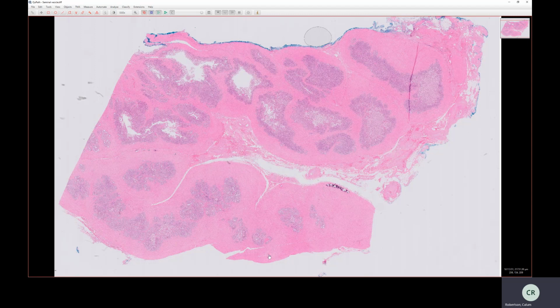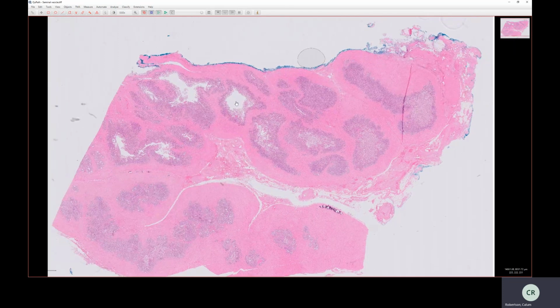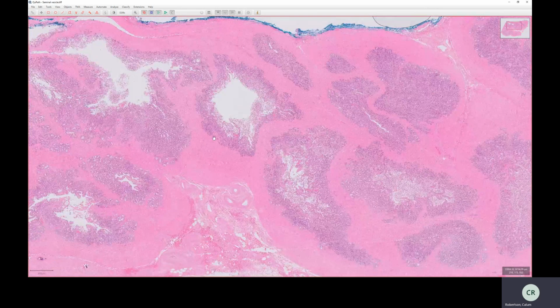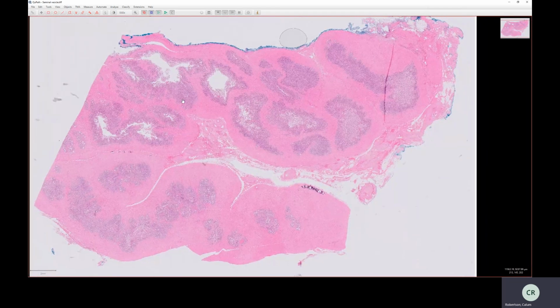The seminal vesicle. There's another one. There's another one. This is a bigger one. These are all connected and all opening into the same duct to discharge the seminal vesicle product, and they all have the same appearance where you've got glands around the outside, all opening into a central sort of duct system. It's almost got a tree-like architecture, or an organoid architecture where it's all organized, whereas if it were infiltrated with adenocarcinoma, it would be haphazard and it would just be infiltrating all over the place.